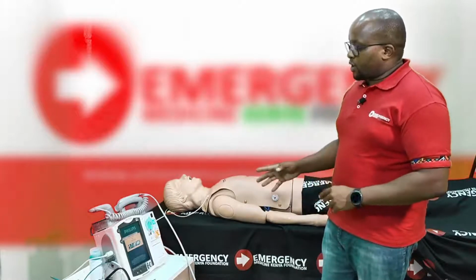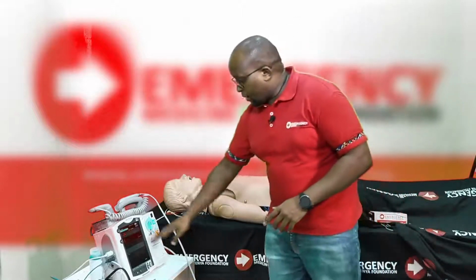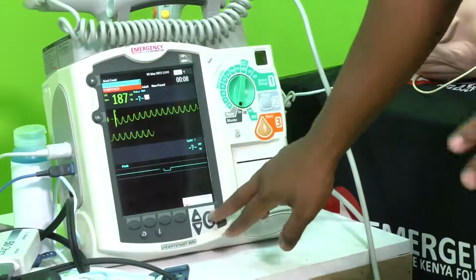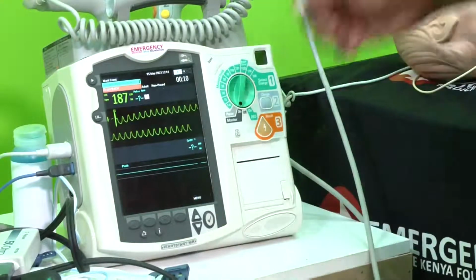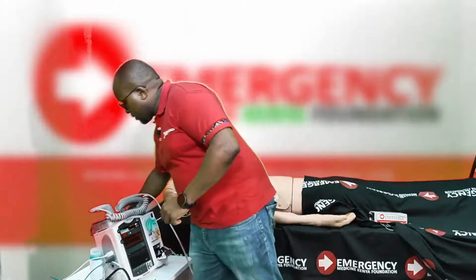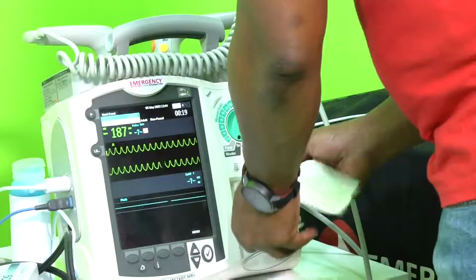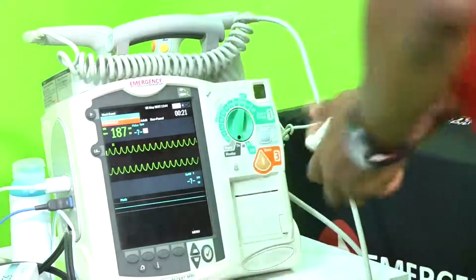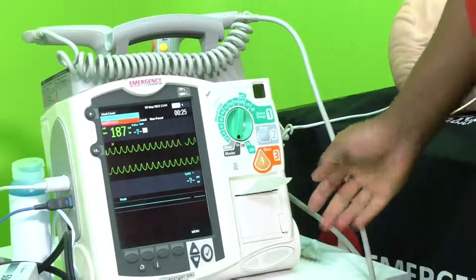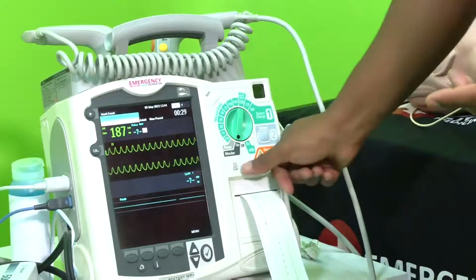In this particular patient, I can see my patient's heart rate is going extremely fast, at 180. Now, this is a situation where potentially you want to get a rhythm strip. So I'm just going to put back my paper. This is a situation where you want to get a rhythm strip, or a 12 lead ECG if possible. A rhythm strip is faster to get.